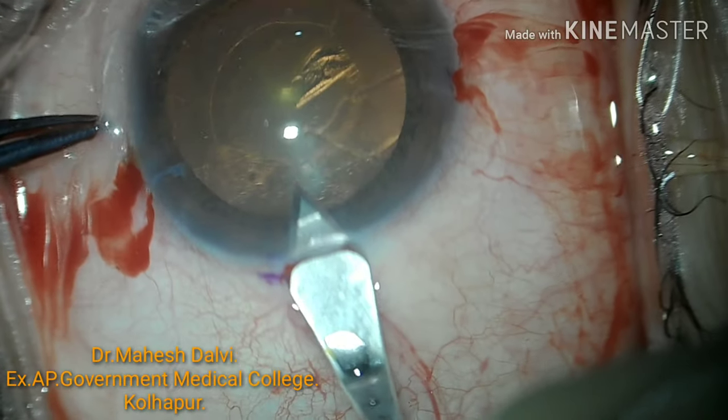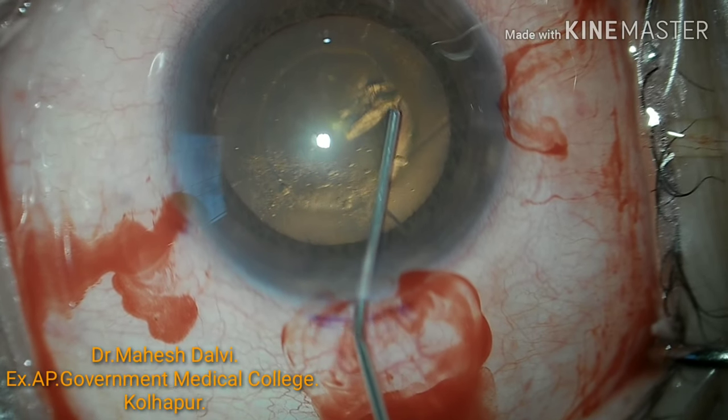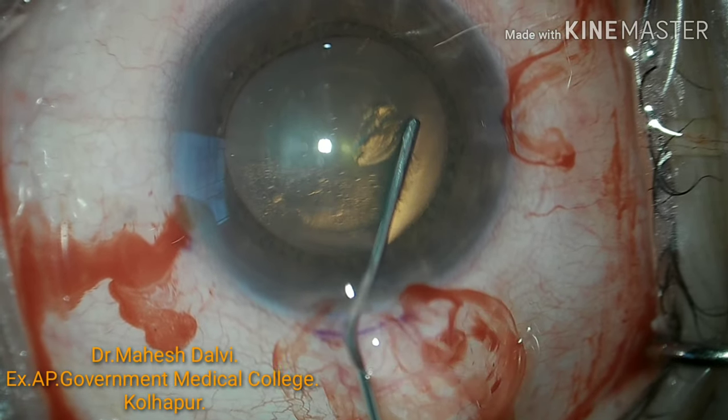Here the main port is marked and entered. Here I am doing the hydrodissection.